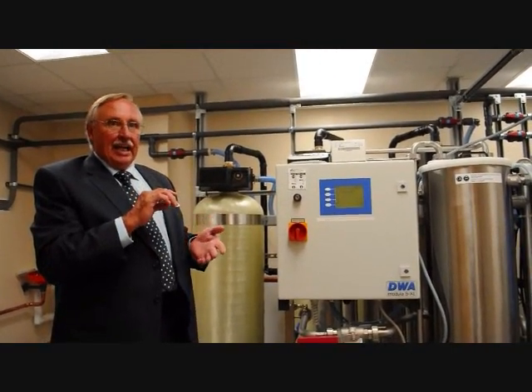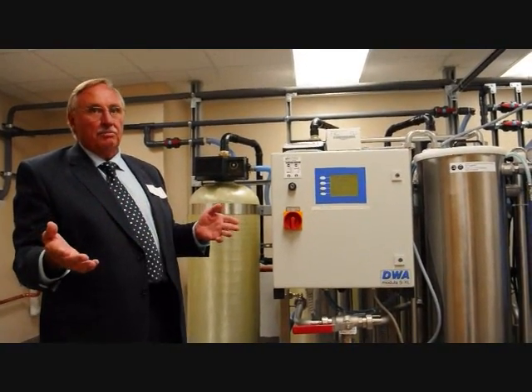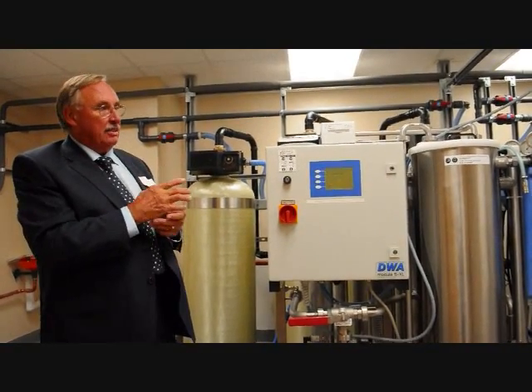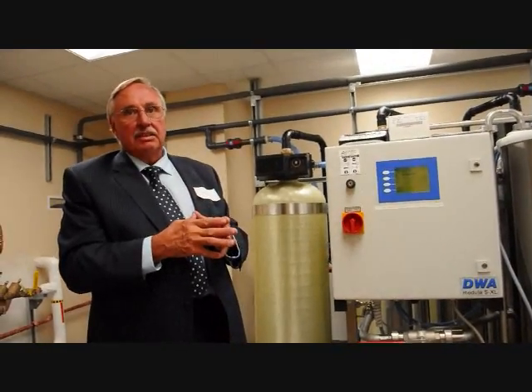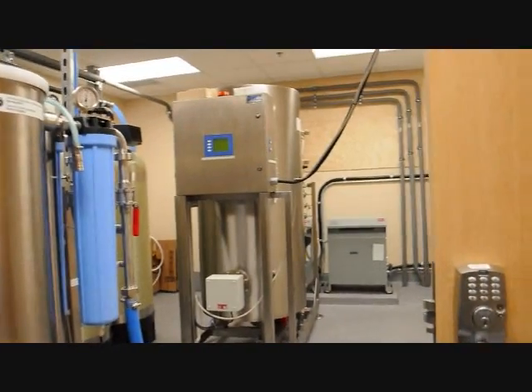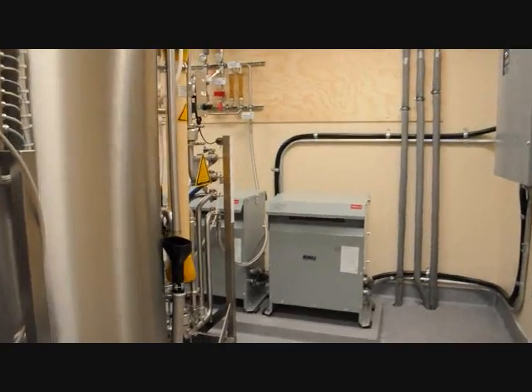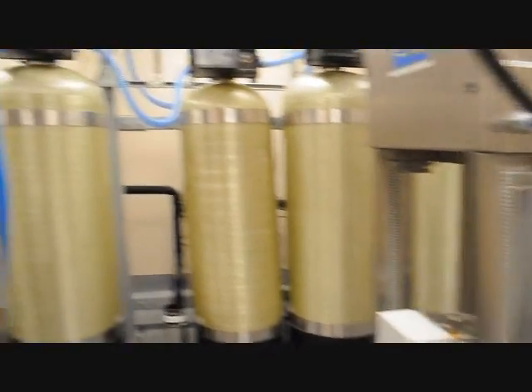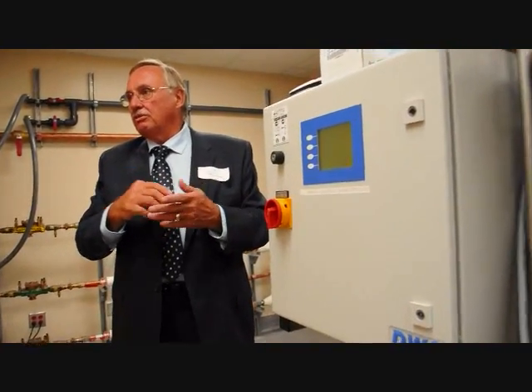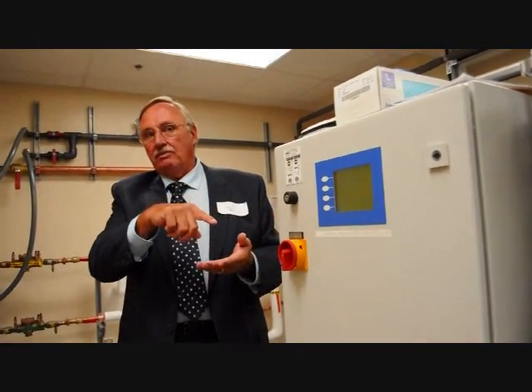The other piece of the thing that is so state-of-the-art with this new equipment is the heat sanitization. Heat sanitization is done every night. We heat the water to 90 degrees Celsius and then pump it around, out and around the loop to each one of the bed heads, all the way around. It can go through each one of the dialysis machines if they select that, so that even the machine is ultra-pure clean, and then it comes back around and is disposed of down the drain.